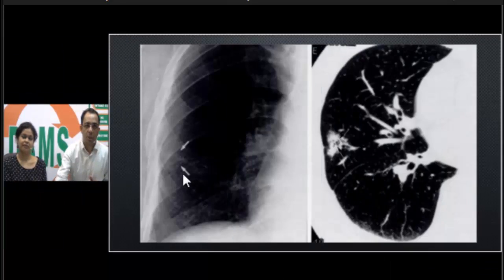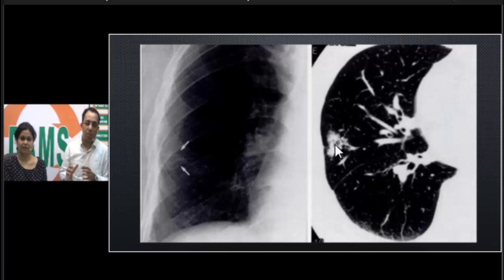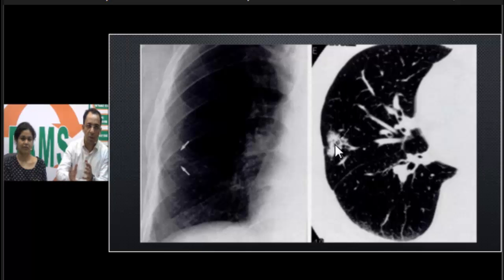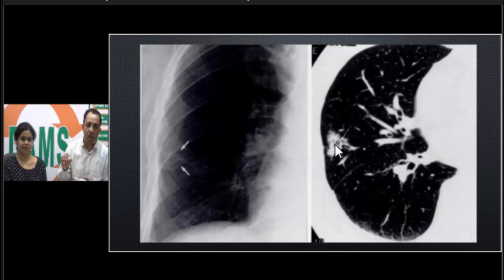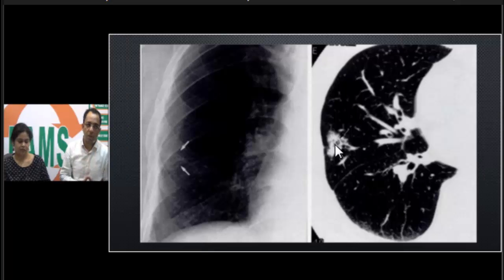Looking at this X-ray chest and CT, you can see a single pulmonary nodule. The key finding in this nodule is a bubbly appearance — this is called pseudo-cavitation. This is very typical because the bronchi and airways are patent. It is like an airspace lesion where the airways are patent, so you can see bubbly air lucencies within the lesion. It may look like a single lung nodule with a bubbly or pseudo-cavitation appearance.